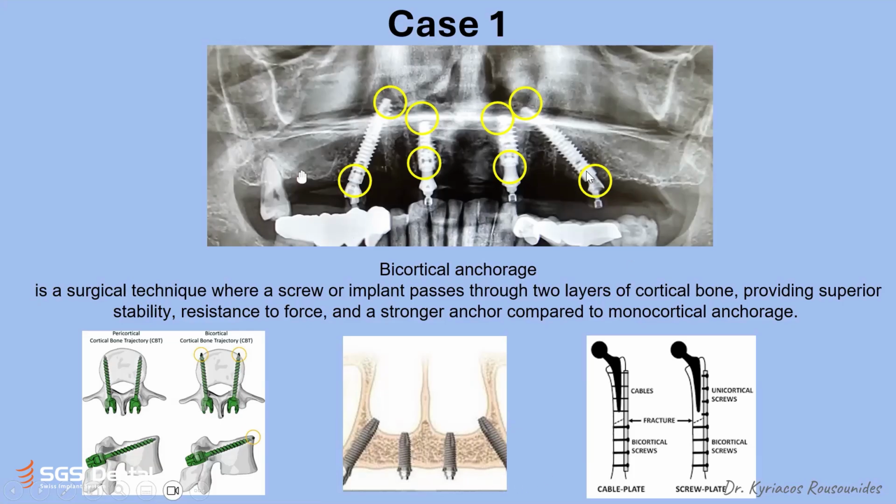And if we have this anchorage in both parts, even if it's 1 or 2 or 3 millimeters in the nose, it doesn't matter. It's still the first spirals, the first threads of the implant. They are still attaching to the cortical bone.